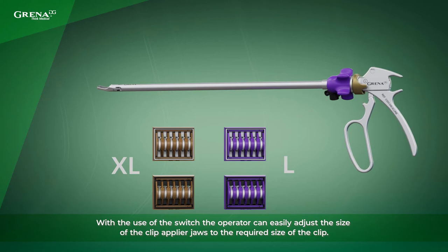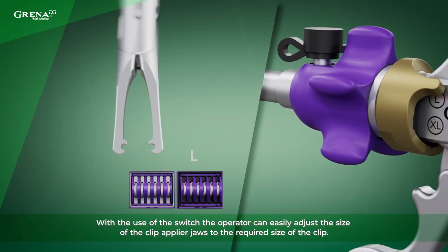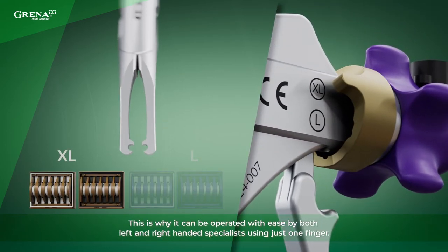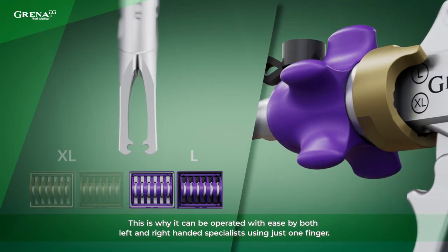With the use of the switch, the operator can easily adjust the size of the Clip Applier jaws to the required size of the clip. The switch can be easily found at both sides of the Clip Applier, so it can be operated with ease by both left and right handed specialists using just one finger.